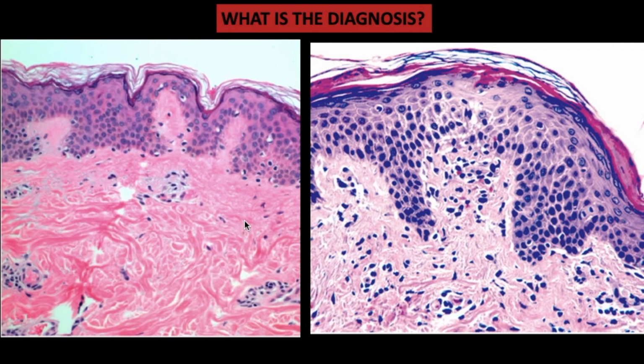Moving on, here compared to the normal skin, the pathology is limited to a specific area, along with the hyperkeratosis and some inflammation in the dermis. So we have hyperkeratosis, parakeratosis, and absence of a granular cell layer underneath the hyperkeratosis and parakeratosis.